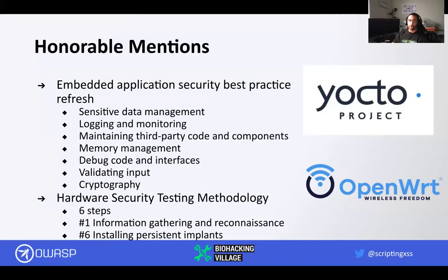And again, it's for those folks who need that guide rail, a little bit of a kickstart, something to keep you honest and reference, like, hey, I'm ensuring I'm covering these certain areas for these vulnerable hardware debug interfaces, these UARTs, these serial interfaces, these JTAGs. How do I connect to these? What do I do afterwards? How do I gain root access and gain persistence? So we hope that these resources will be helpful to you all.